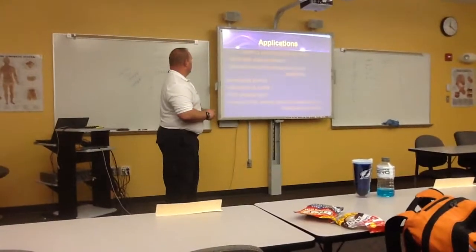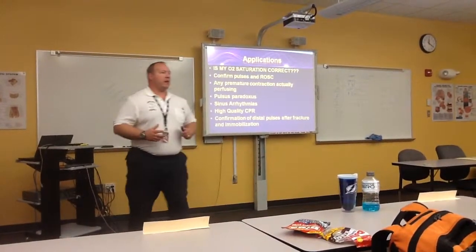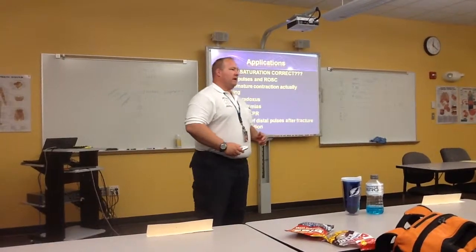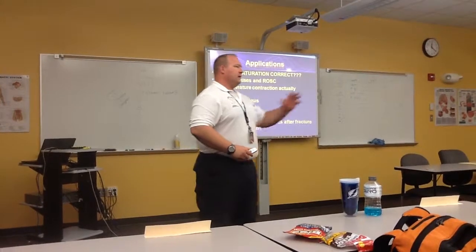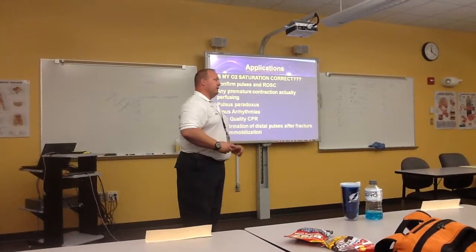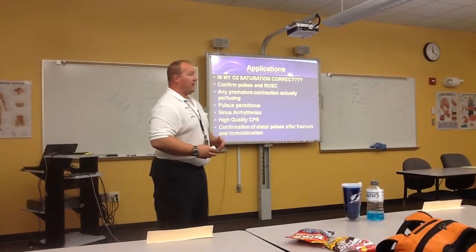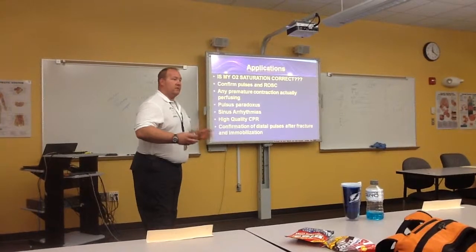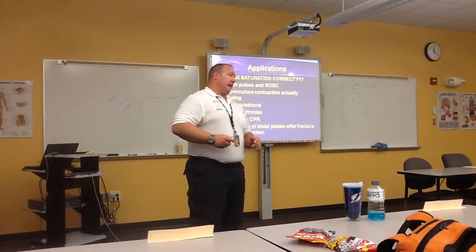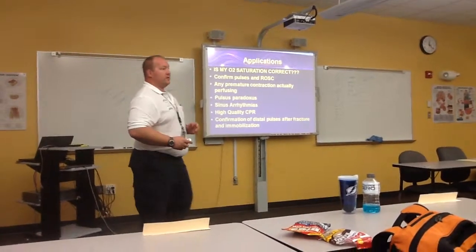Applications. We're going to talk about some applications. First question, is my O2 sat correct? When you bring up your monitor and it says lead 2, 3, aVF and you see a pulse ox of 99 and the patient's blue or hypoxic, you can switch it to the pleth wave and see if that wave's actually correct. See if there's a wave there. If there is, then that wave is right. Maybe there's something else going on. What if it's wrong? What if it's a straight line? That means that the pleth wave is incorrect, and the sat that you're getting is wrong.